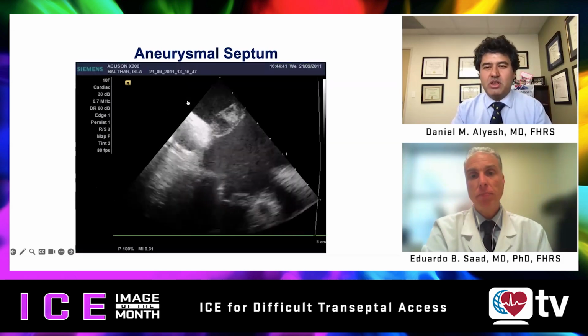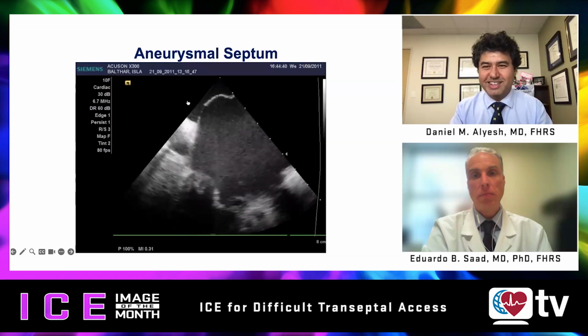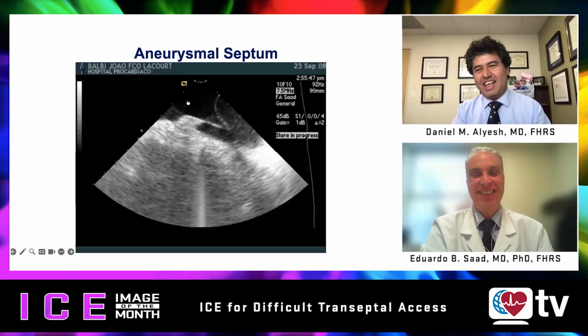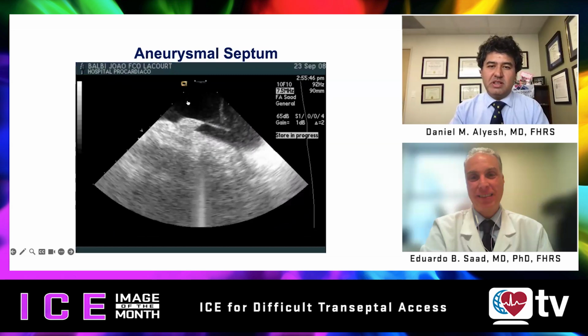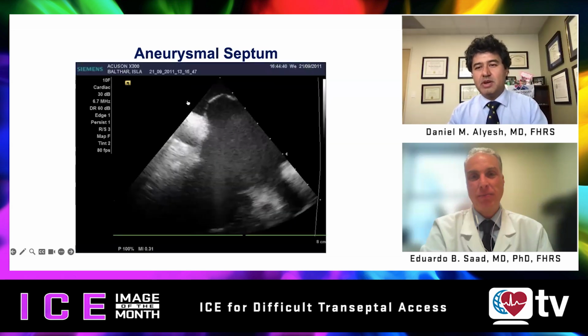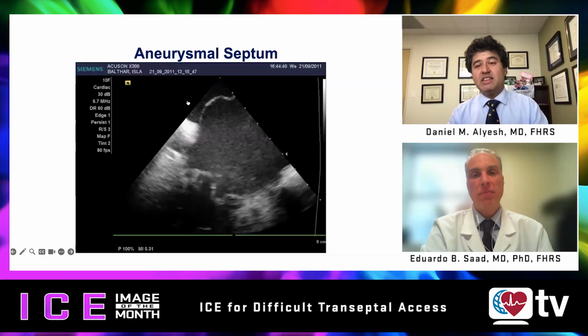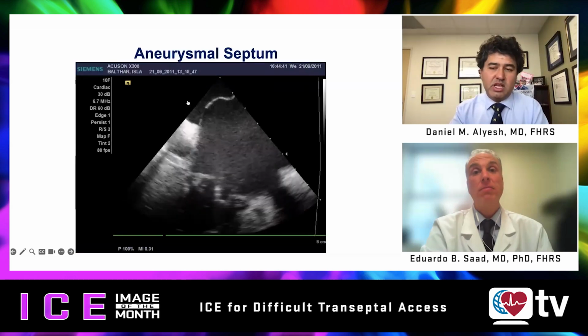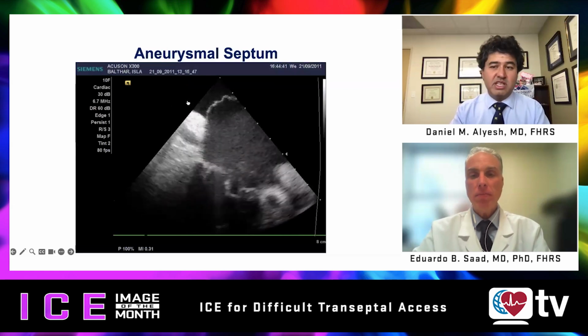Yeah, I always say with EP, the solution is rarely pushing harder. Yes, and in this situation, the more force you're applying, eventually you're going to push towards the posterior wall. Say you actually get that jump, you can get yourself into a lot of trouble. I agree that some sort of powered needle or assembly is helpful.